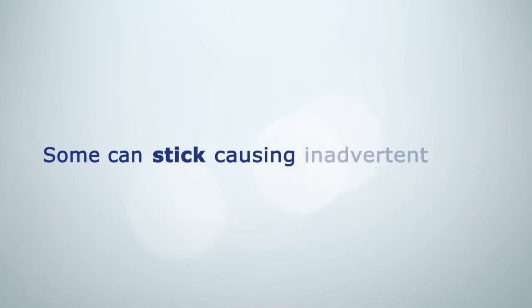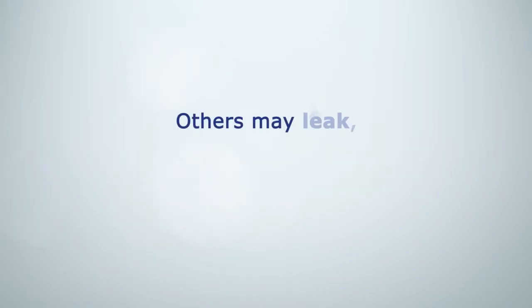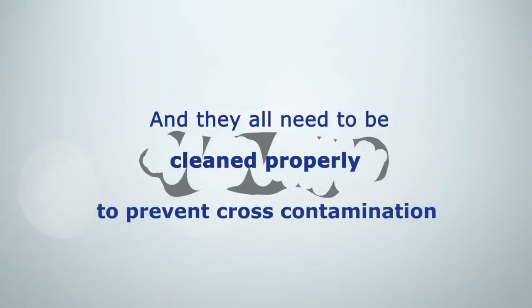Some can stick causing inadvertent PEEP, others may leak or be assembled incorrectly, and they all need to be cleaned properly to prevent cross-contamination.